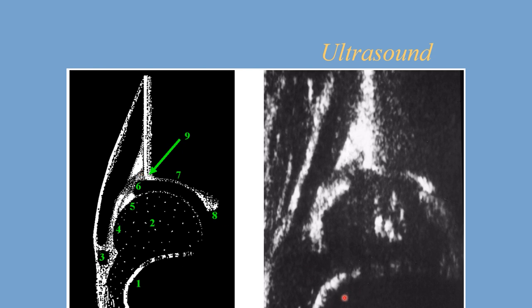Repeating these important structures on the image: the chondro-osseous border, the femoral head — which you can see starting to ossify, suggesting the child is around 3-4 months — the synovial fold, the joint capsule, the labrum, the cartilaginous roof, the bony roof, the lower limb of the bony roof. The concavity transitions to convexity at the turning point. Lateral to the turning point there is usually an acoustic shadow, because the ultrasound beam hits the bone and creates a shadow behind it. The ilium appears as a straight line.